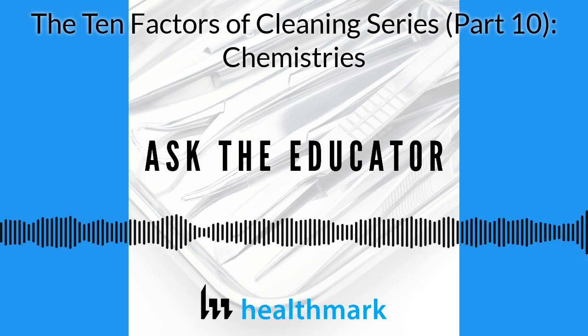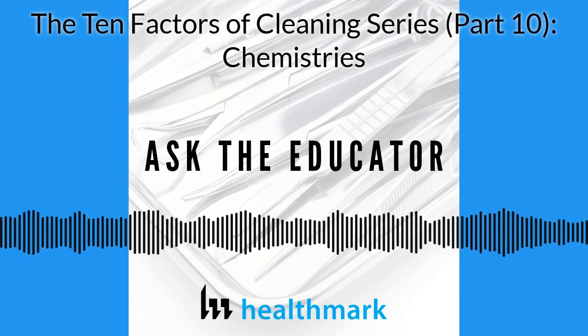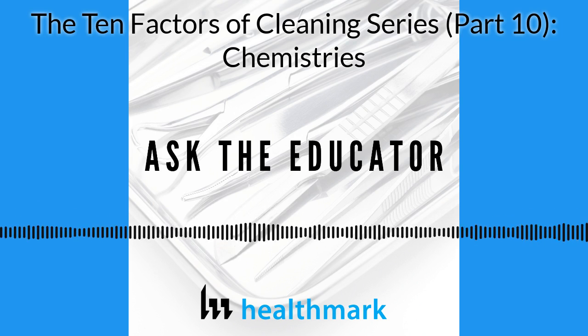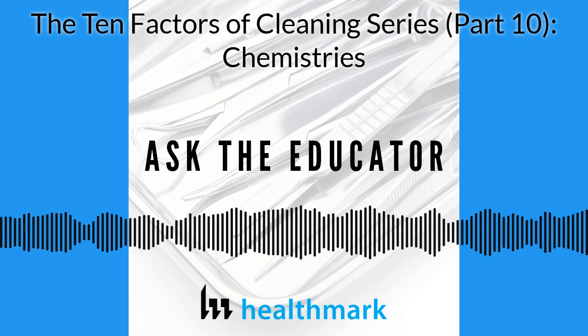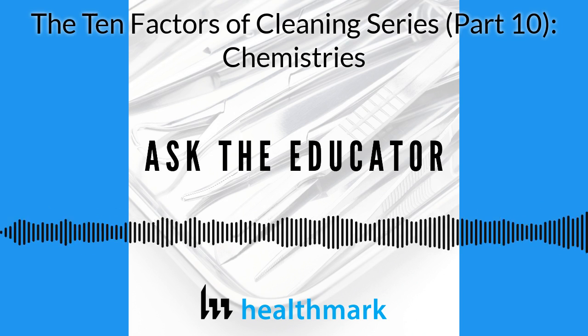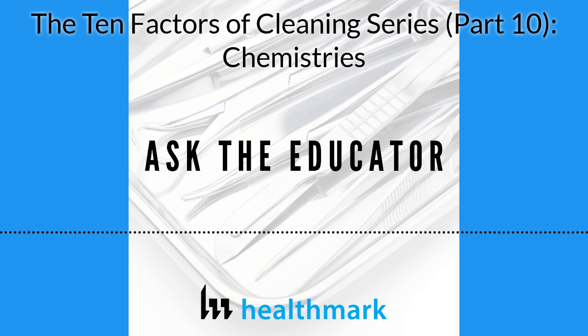Secondly, know the IFU of your chemistries and your devices so you can select the proper chemistry for the job. And lastly, cleaning solutions are not regulated by the FDA, so it is up to you to do your research. ASTM is developing ways to test these solutions, but until then, we need to do our best to educate ourselves and our teams on how to select and use the proper cleaning agent for the job.